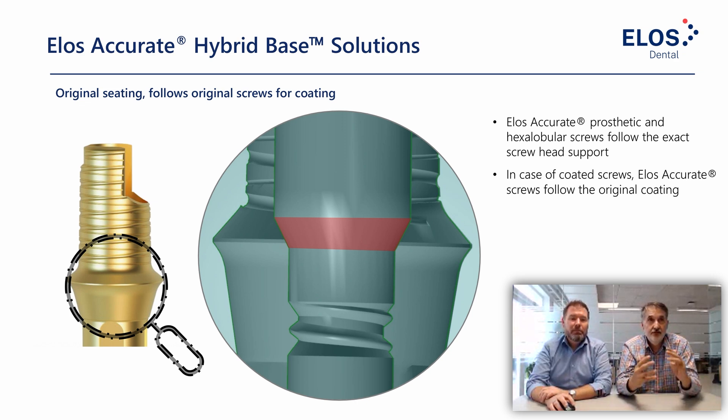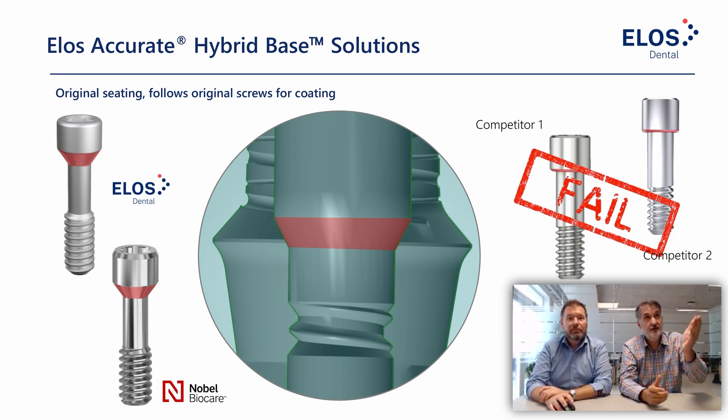Making a section view of the hybrid base, we can see the screw head support marked in red. This area exactly fits the screw head — the screw head support in your hybrid base must match the screw. The ELOS screws always follow the original screw head geometry and the coating of the implant manufacturer. Looking at a Noble Active hybrid base cross-section, you see the screw head layer marked in red — the ELOS screw and the Noble Biocare original screw have the same screw head geometry.